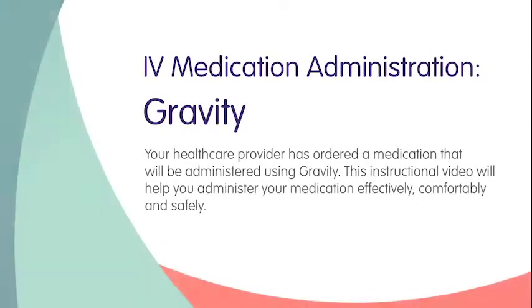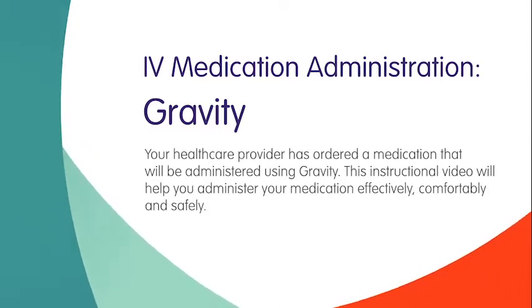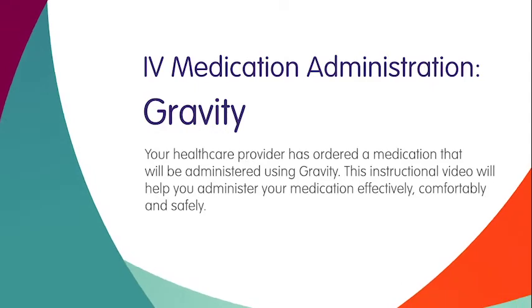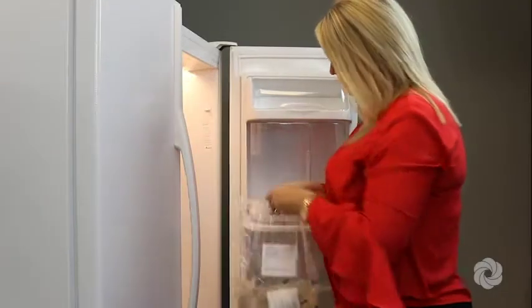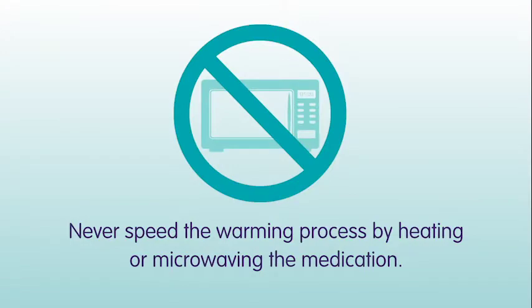Your healthcare provider has ordered a medication that will be administered using gravity. This instructional video will help you administer your medication effectively, comfortably, and safely. To get started, remove your medication from the refrigerator at the time specified on your medication label. Never speed the warming process by heating or microwaving the medication.